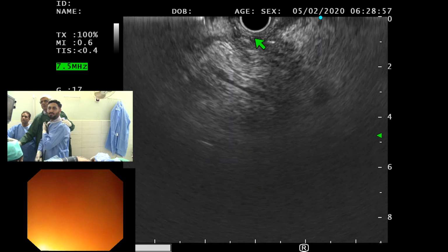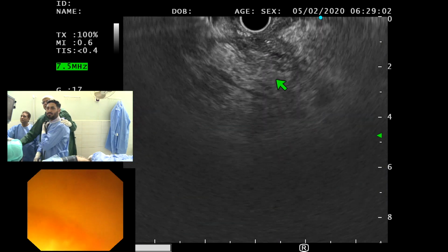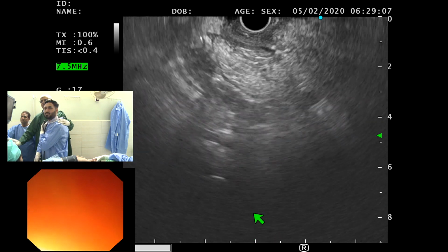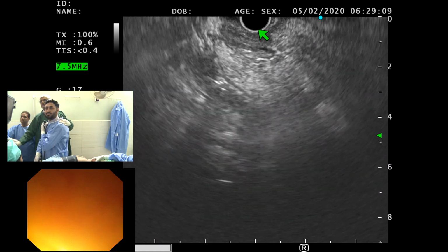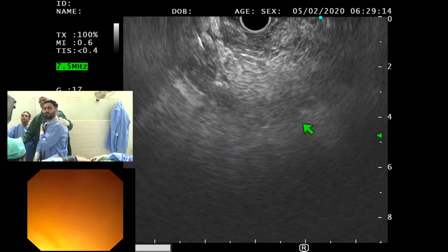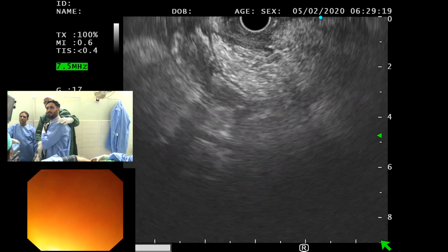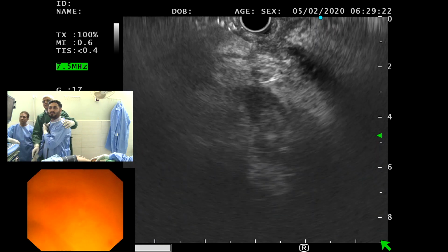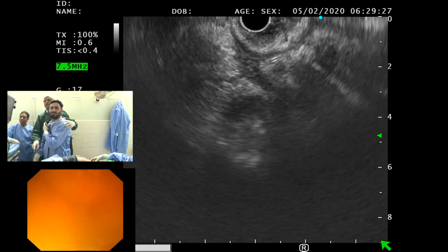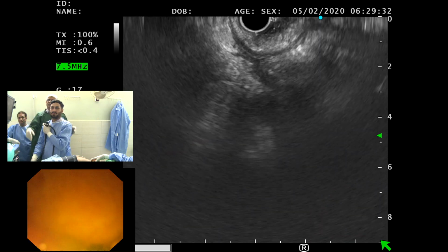So I think the better place for this would be D1 in my opinion, and that's the pancreatic duct. So you've got both ducts, and this is the place where you can quite often see the pancreatic duct going this way when there is pancreas divisum. Otherwise, it's going there, and both the ducts are going into the ampulla. Okay. If you go anti-clock now from here, then you would see the aorta, and then if you go more anti-clock, you'll see the IVC.